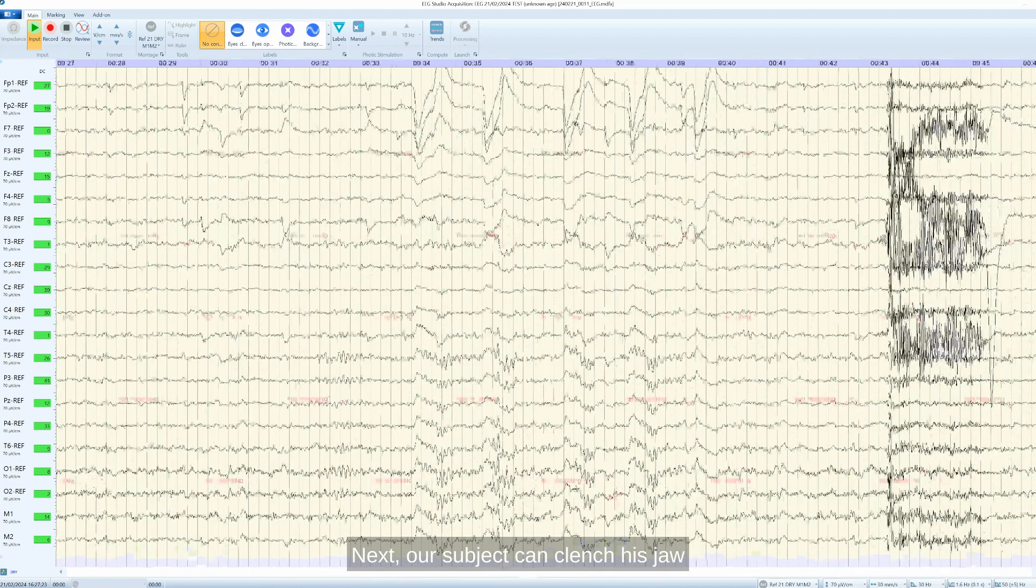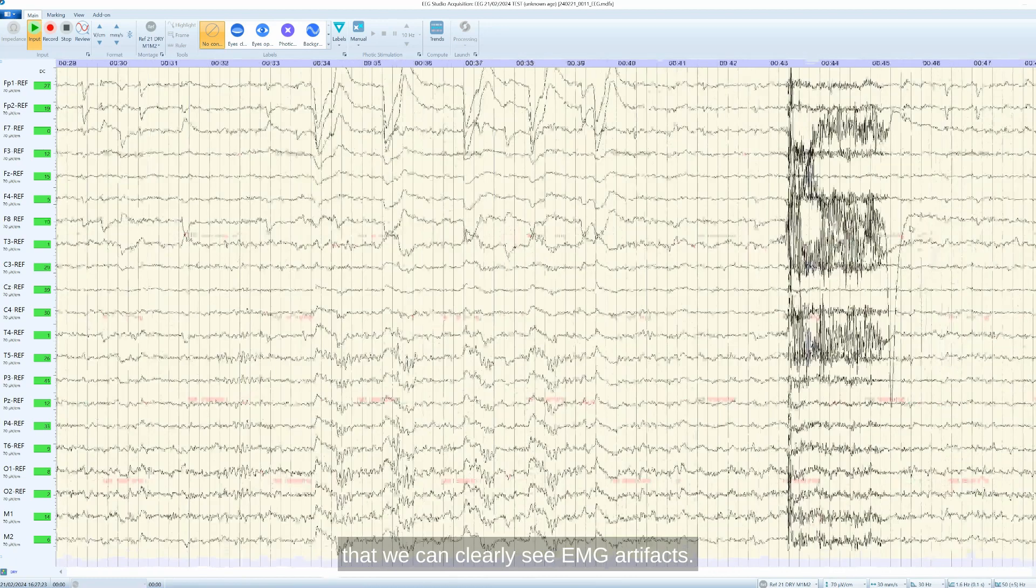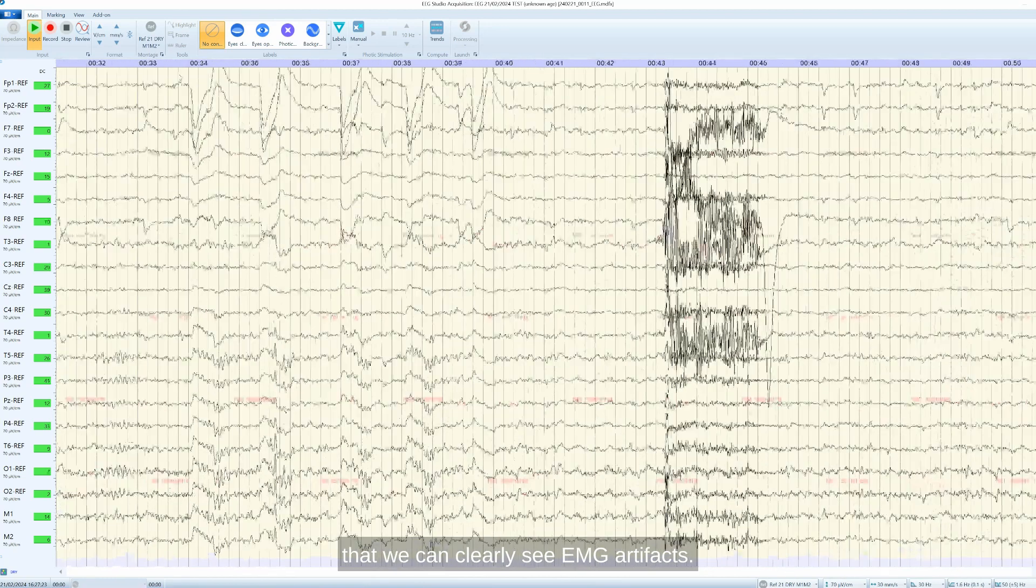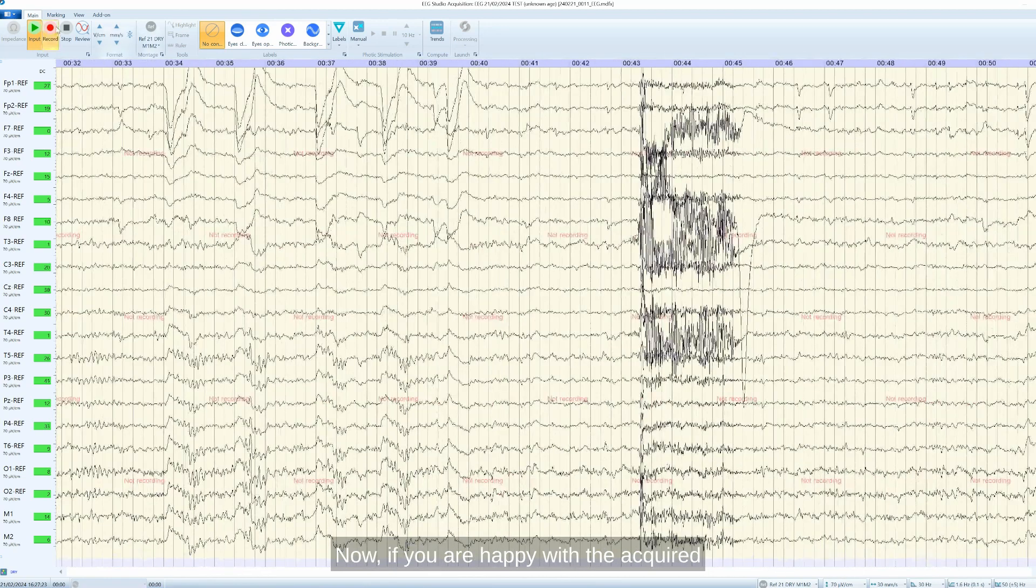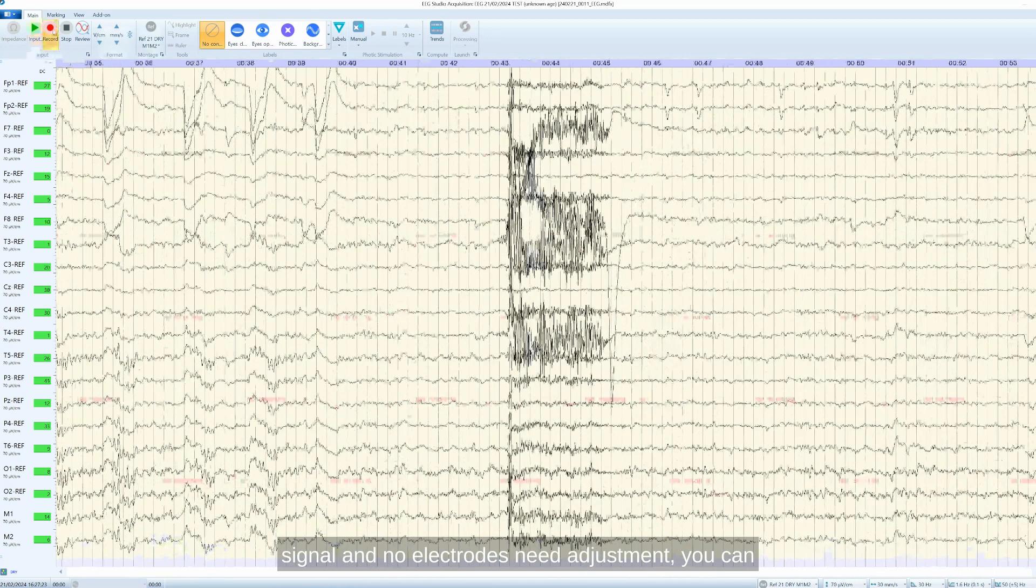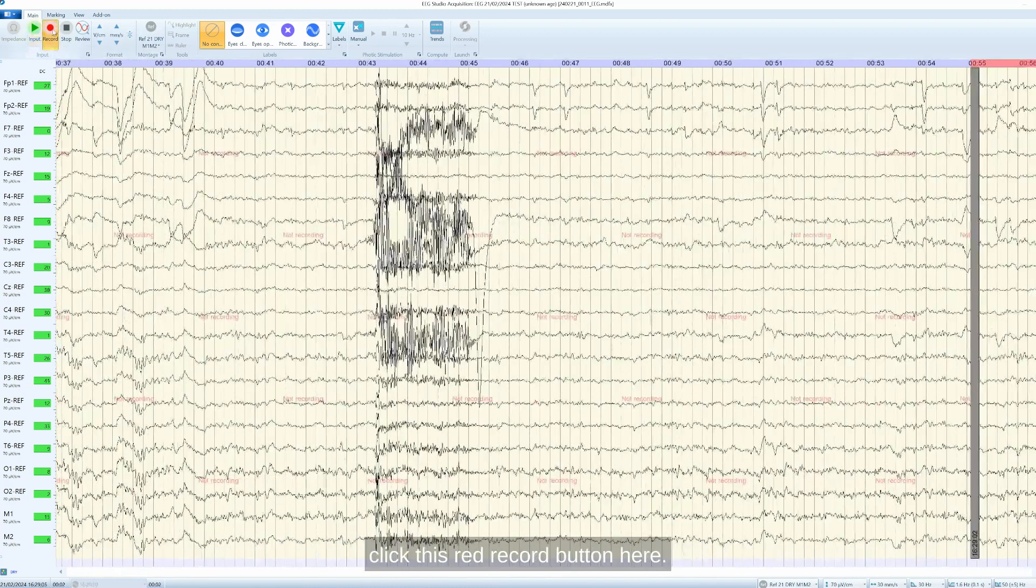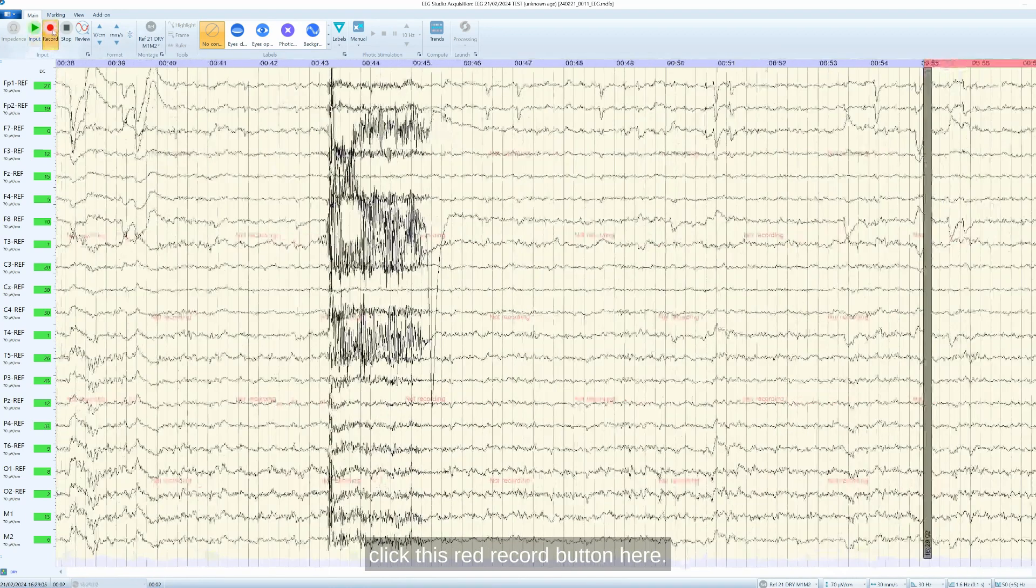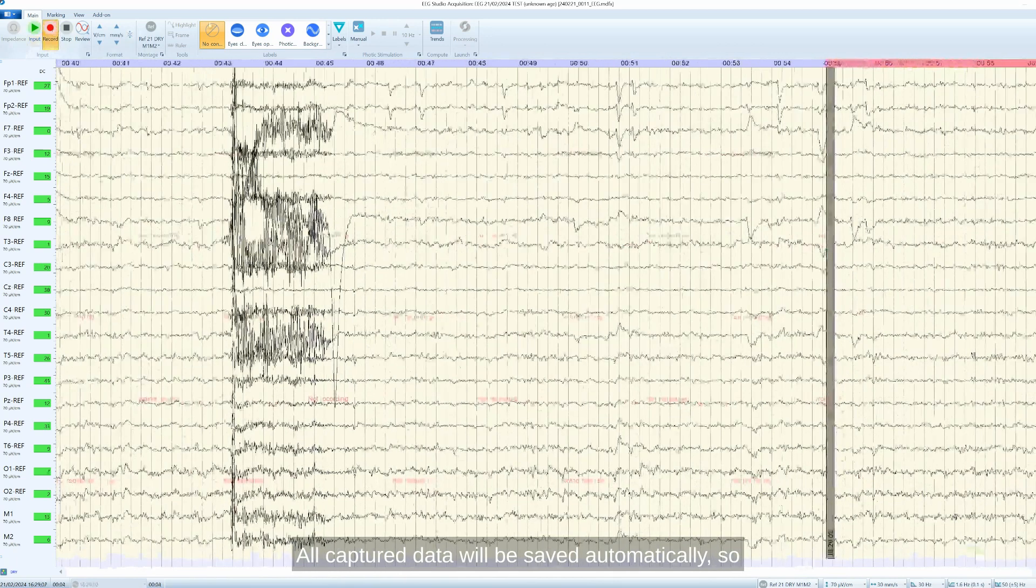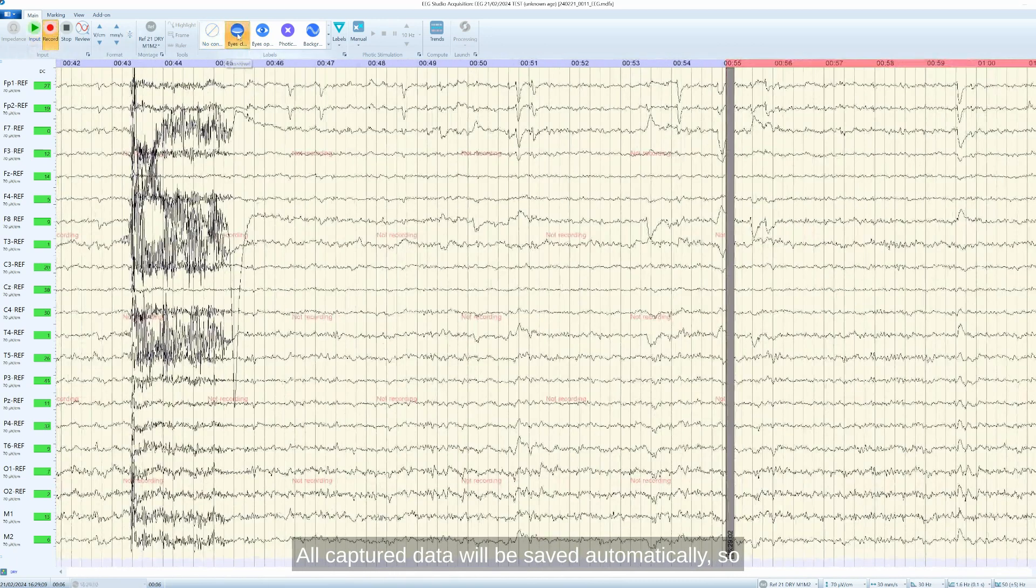Now, if you are happy with the acquired signal and no electrodes need adjustment, you can click this red record button here. All captured data will be saved automatically.